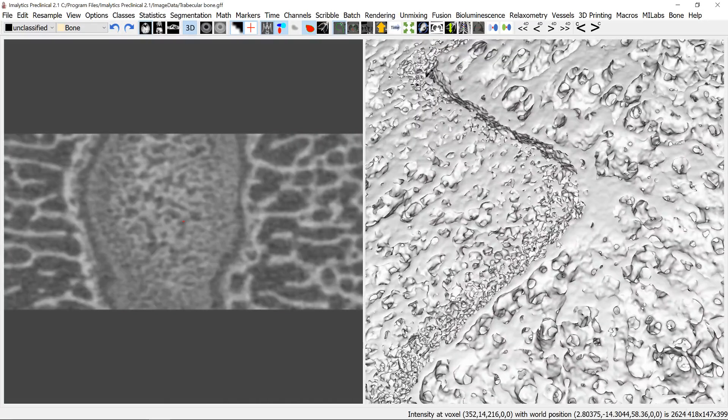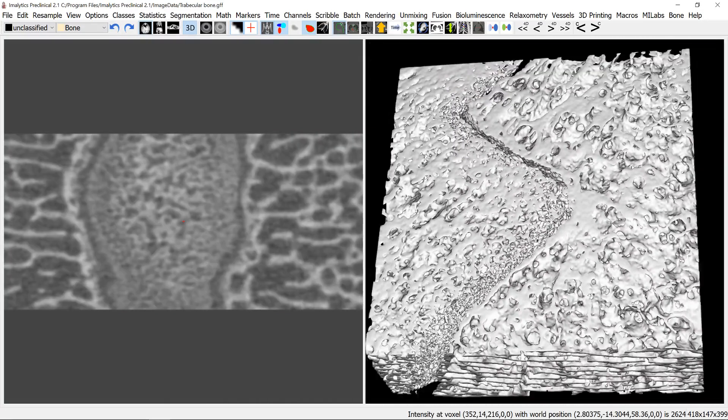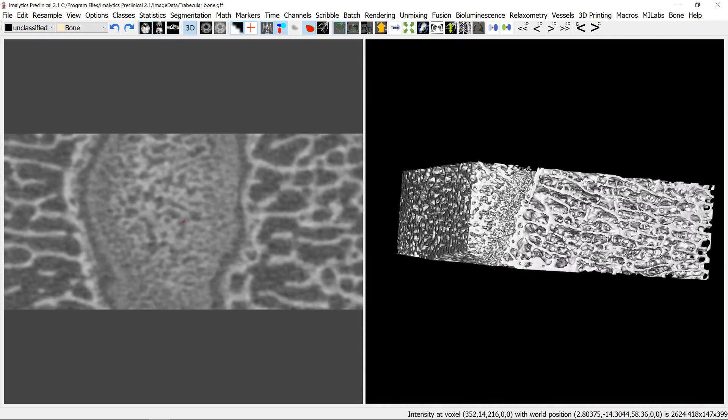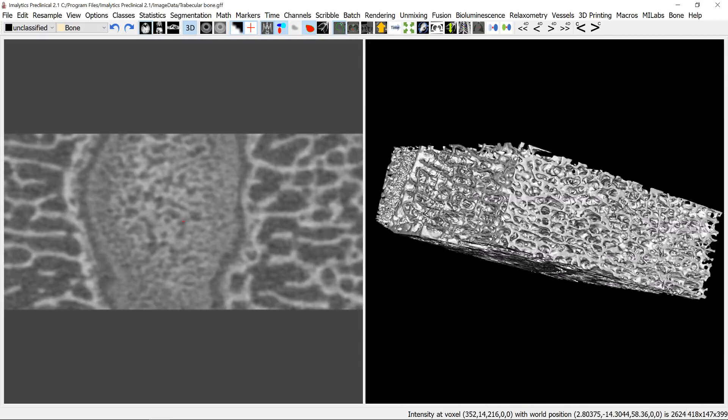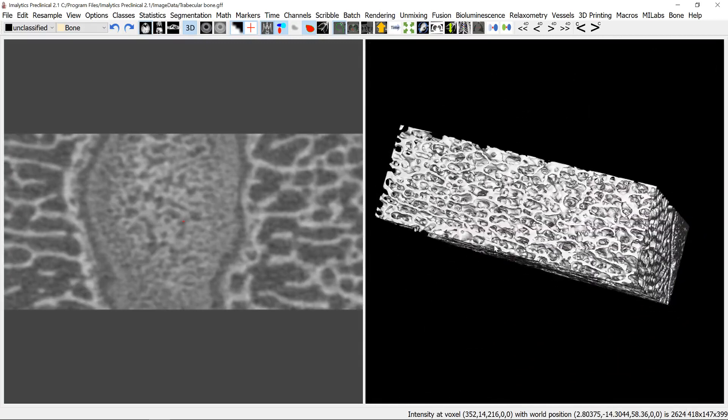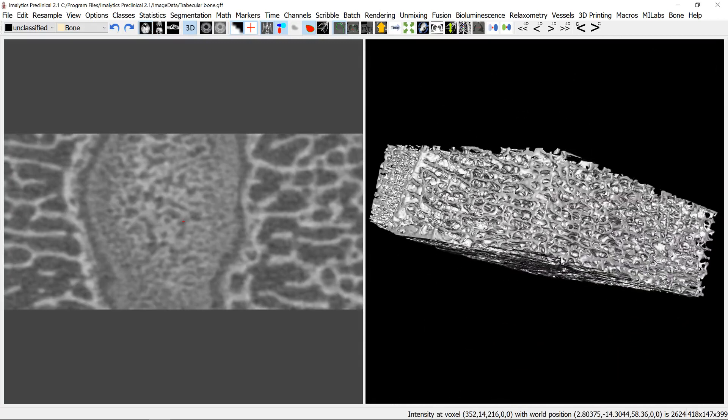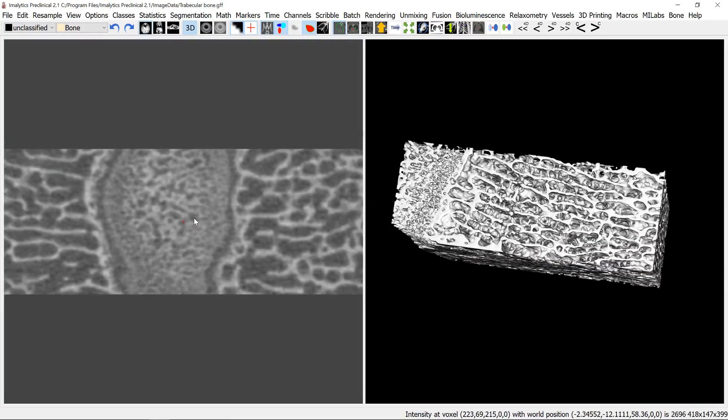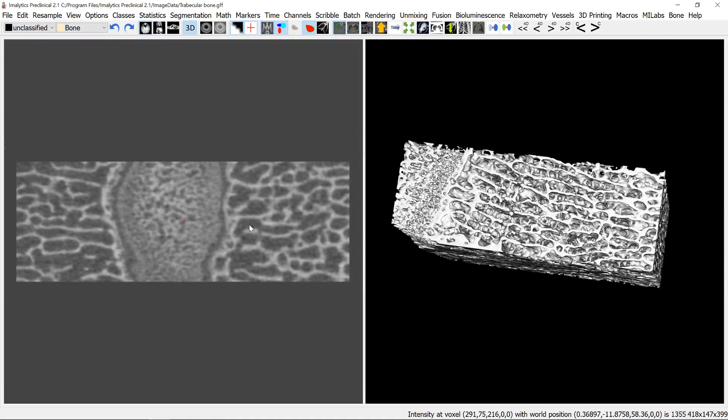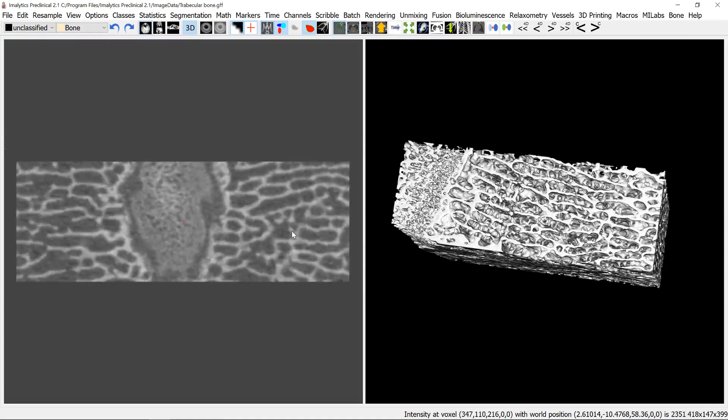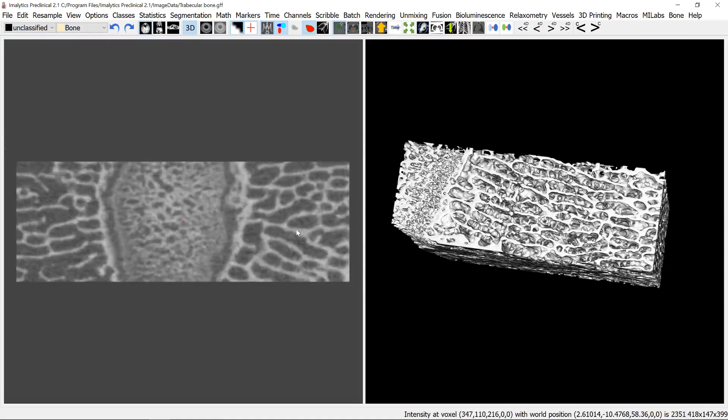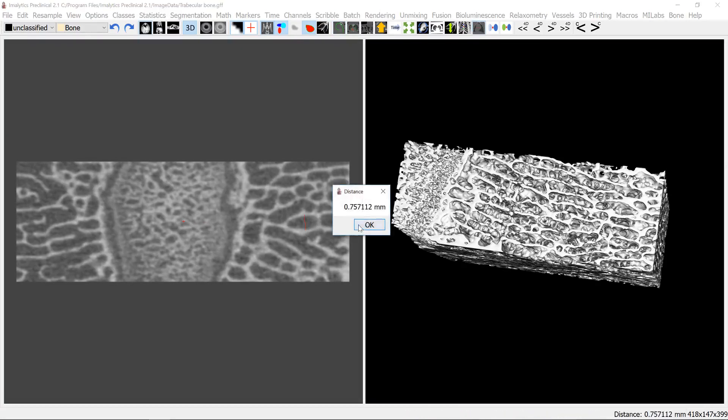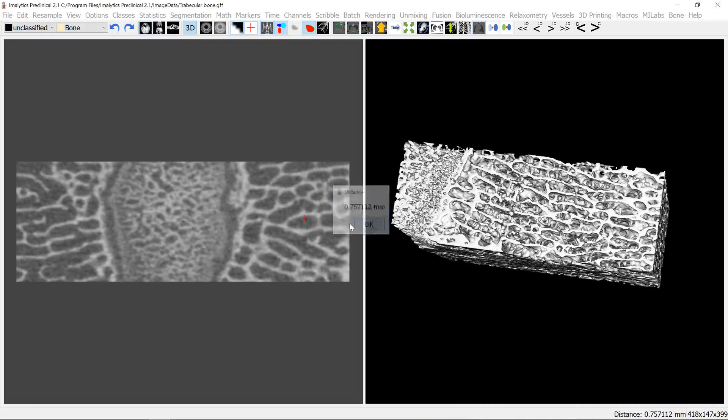So let's look at the bone in 3D here. Looks a bit like a toast so you can see the trabecular structures and what you can see here is that there are different regions. Here at the side we have more, it looks more spongy, we have these big gaps. You can measure the distances between the bone walls, 0.75 millimeters.